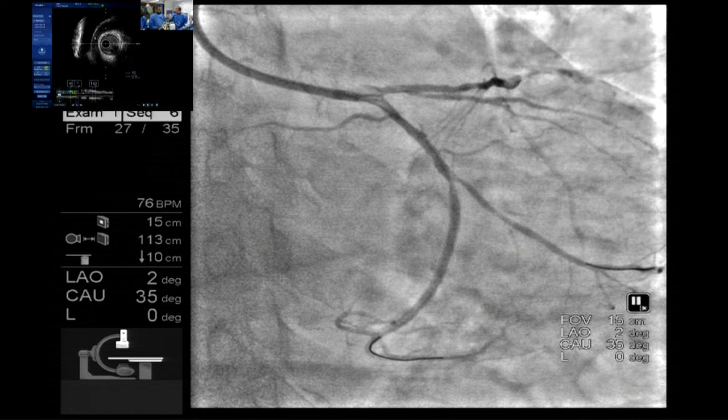Okay. 2.5, 24 stent first. And I want to have an NC balloon at the main branch. The main branch, can I see the second IVUS? What is the size of the distal vessel? The 2.5 stent in the side branch, 24. And the main, this is the main branch, what is the vessel size? Distal is 2.75. And the proximal is a 3, you know, bifurcation. It's a 3.5 or 3.0. Before the bifurcation.